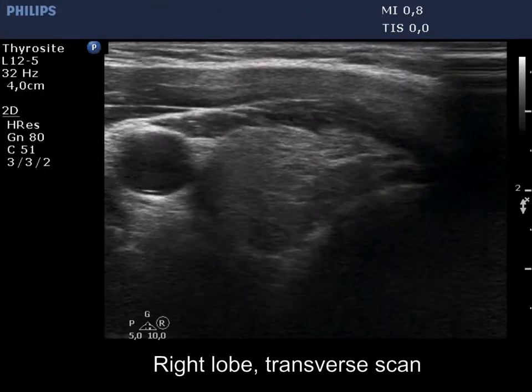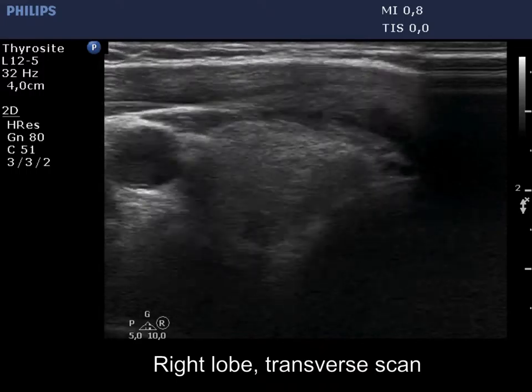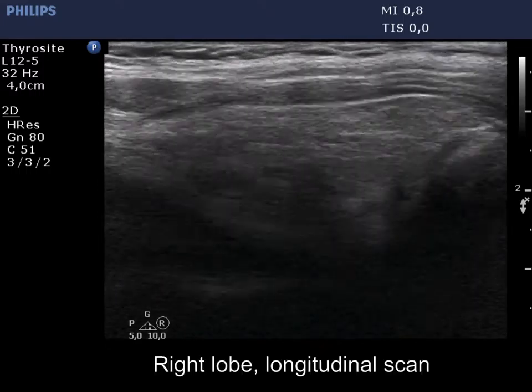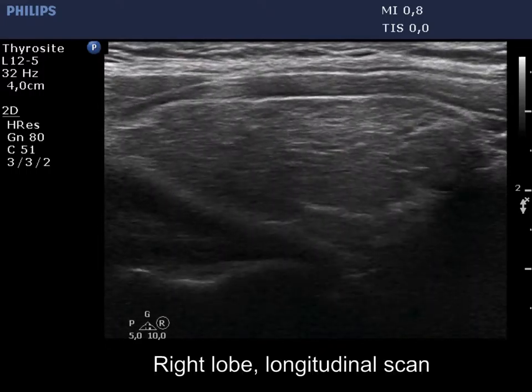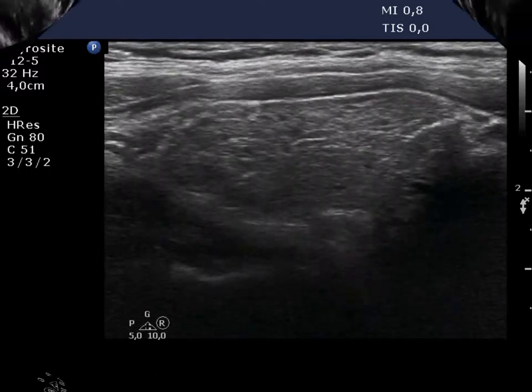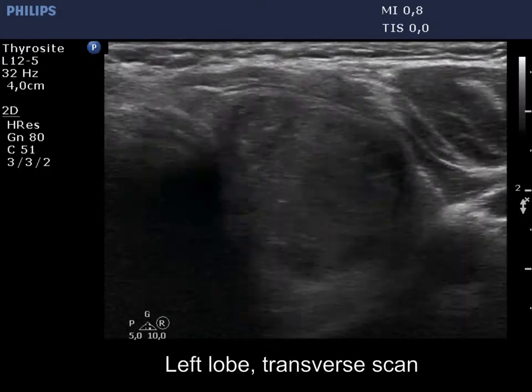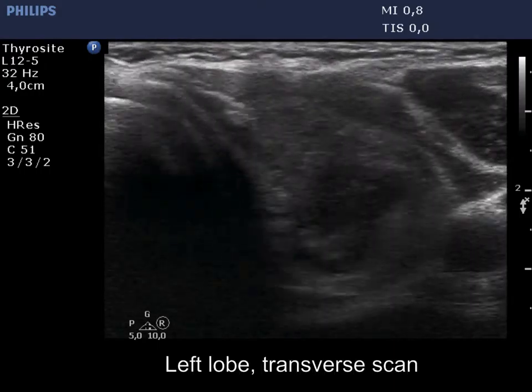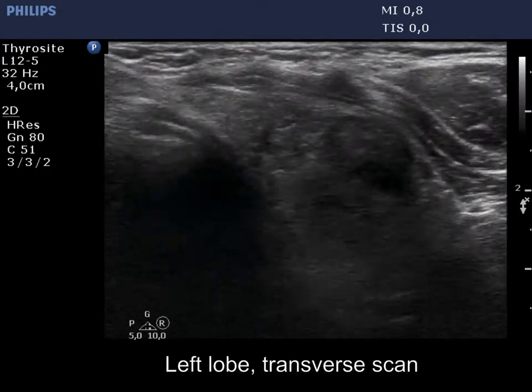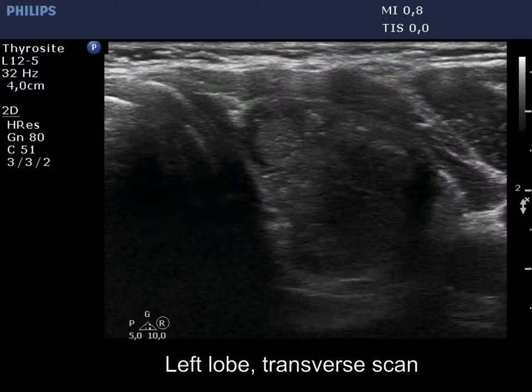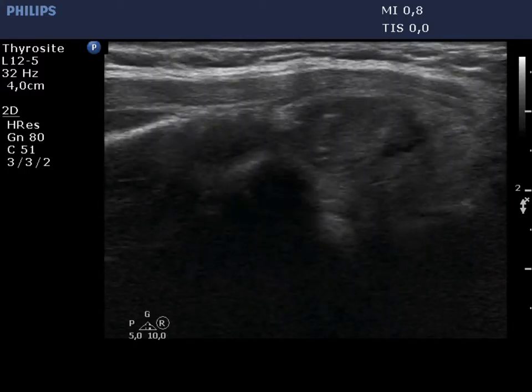The thyroid is moderately hypoechoic and inhomogeneous. Note the presence of connective tissue. The left lobe has a similar presentation.